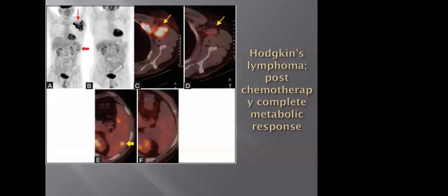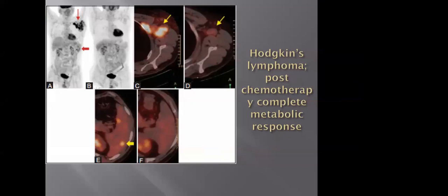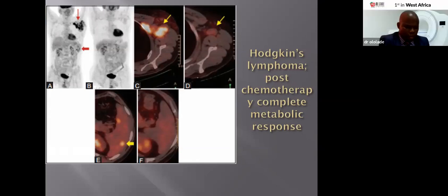It would fall in the category of Deauville 2 score, saying that this is a complete metabolic response, and whatever is remaining is just a post-treatment morphologic residue and not residual viable disease. Next slide, please. Next slide.